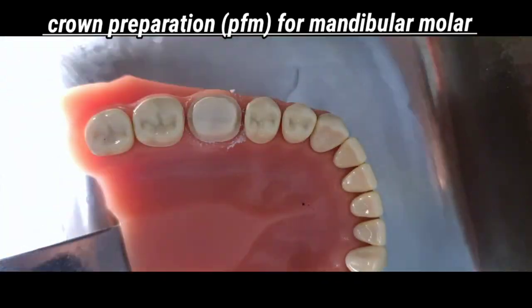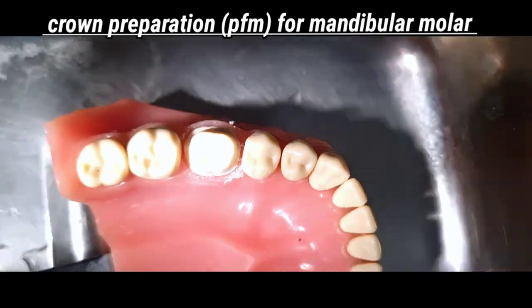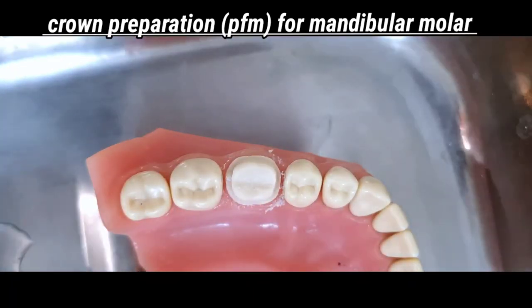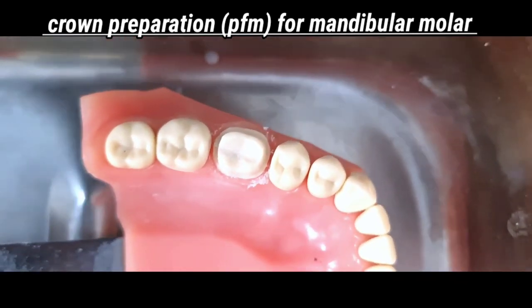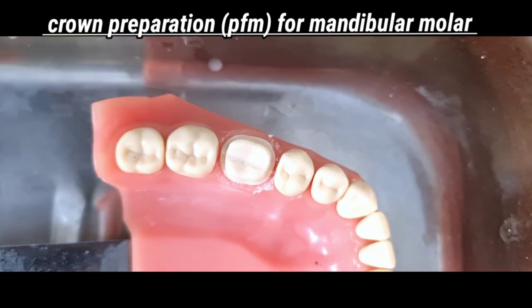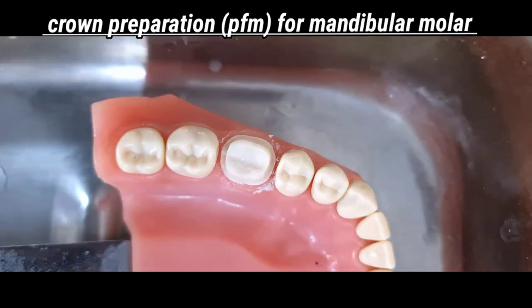The final look of the preparation should be smooth and should be free of undercuts. When seen occlusally, all 360 degrees of the margins should be continuously visible. Close one eye while observing, because if you see with both eyes open, undercuts can be perceived as near parallel surfaces. Special care should be taken to check between proximal and buccal or lingual reduction, as these are the common sites for undercuts. There should be no undercuts.